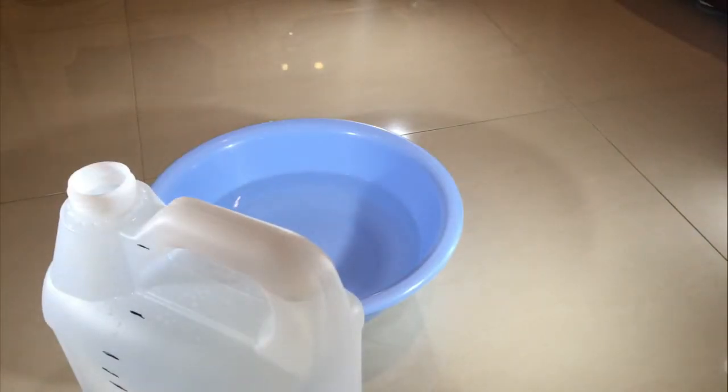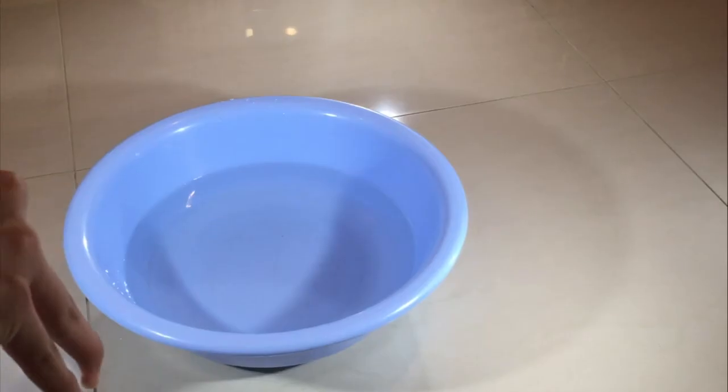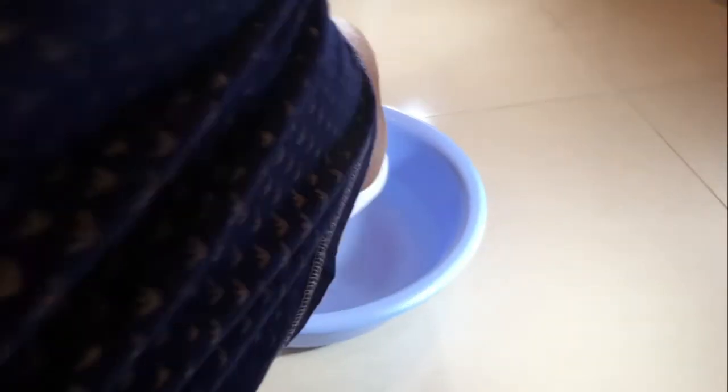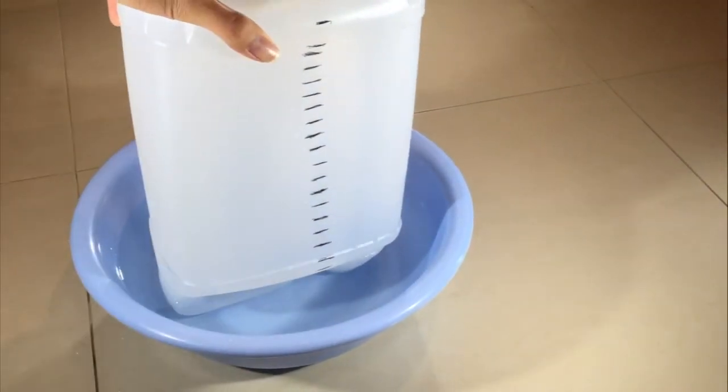5. Put your hand over the top of the gallon to stop water escaping when you turn it upside down. 6. Turn the gallon upside down. Make sure none of the water comes out. Place the top of the gallon under the water in the container before removing your hand.